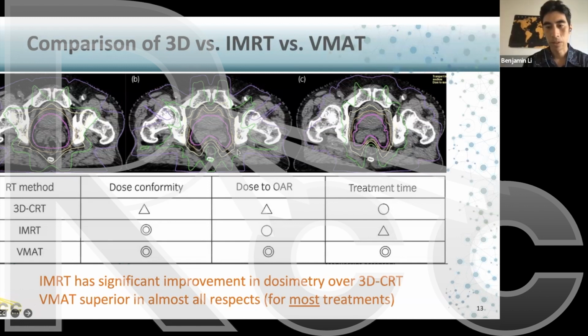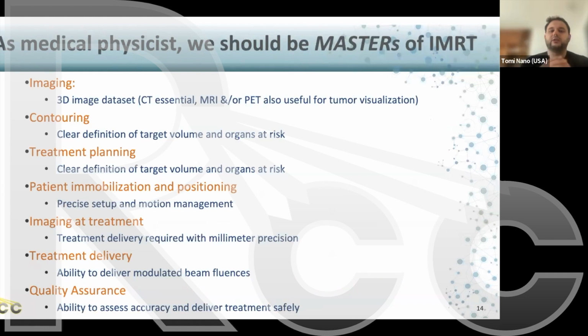Okay, awesome. Great. And there's a good question from Yolandi. Any comments on the number of MU and delivery efficiency? And I think this is actually nice as we're going to get into shielding differences. Totally. I think that's a great question, and it'll lead us into shielding. And there are a lot of differences in terms of MUs, beam on time.